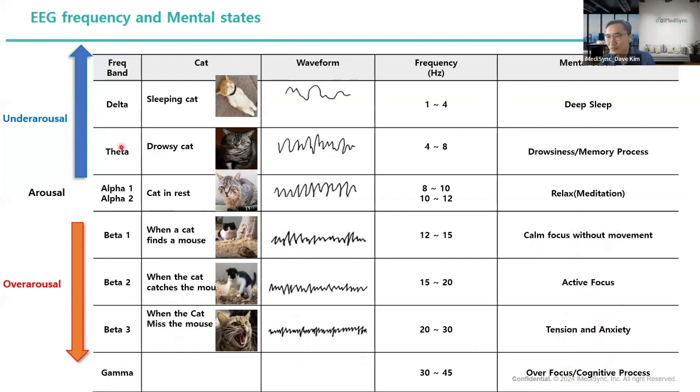These different EEG rhythms generate different mental states. That is the brief understanding of EEG rhythm generation, and each EEG rhythm is associated with a brain subsystem and also with a mental status. That's the introduction part, and after these two sections, in part three, I will go to the iSyncBrain quick recording and how to understand the quick summary report.